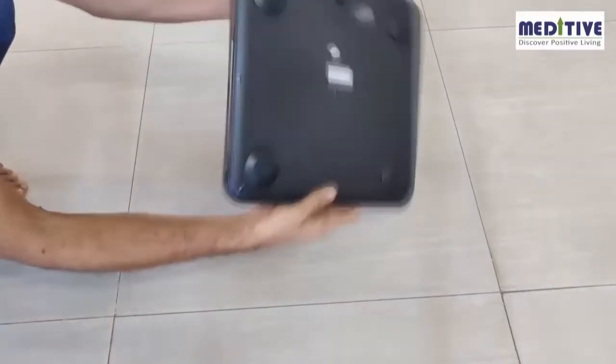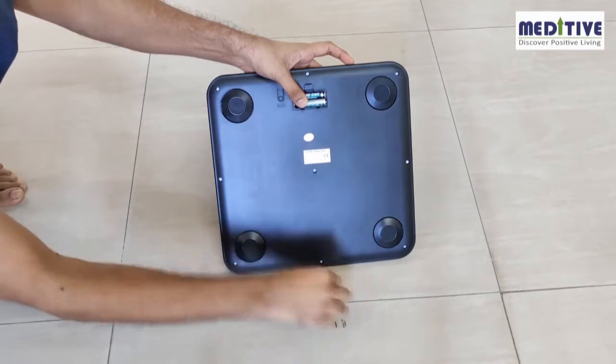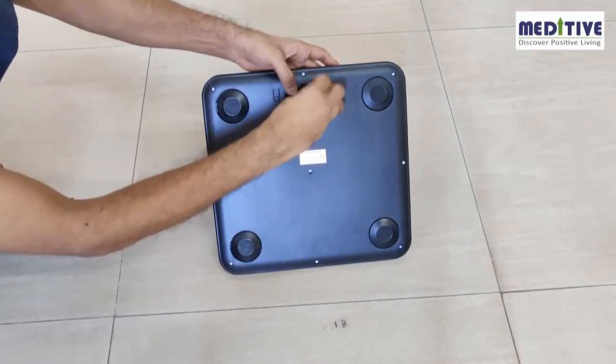The scale is powered using two AAA batteries. First, please check if there is a plastic cap behind the battery — you have to remove the plastic cap and insert the batteries again to switch on the scale.